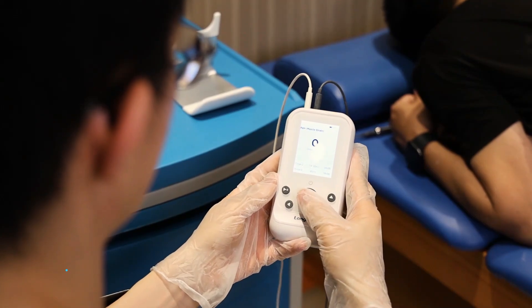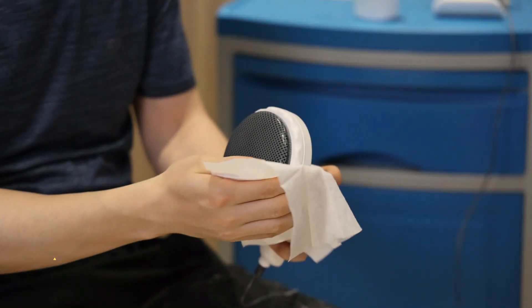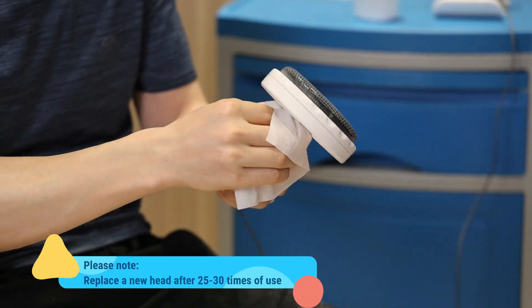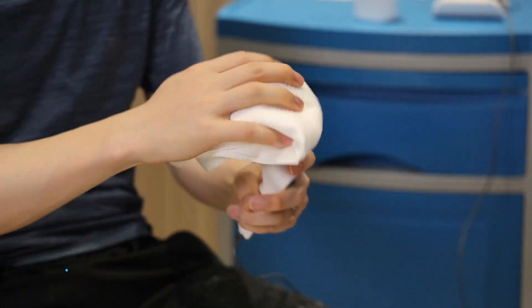After completing the treatment, long press the central button to turn off the device and wipe clean the applicator with a wet cloth. It is suggested to replace the oscillating head after 25 to 30 times of use.